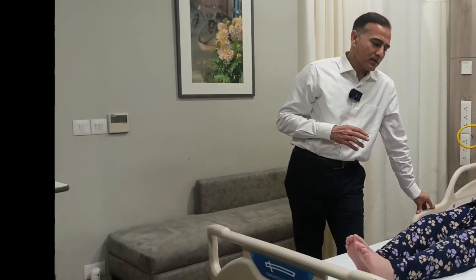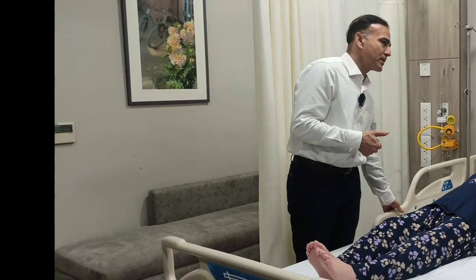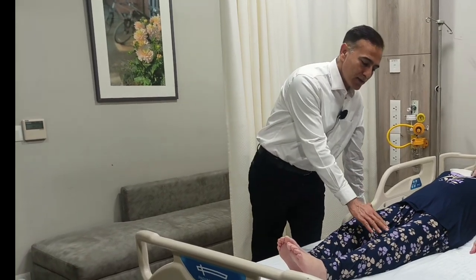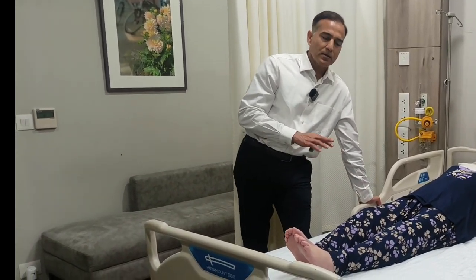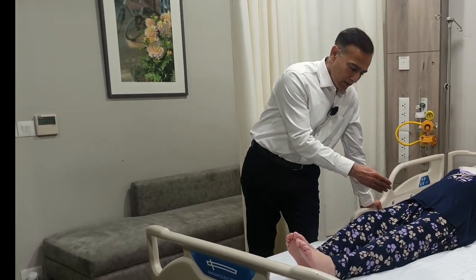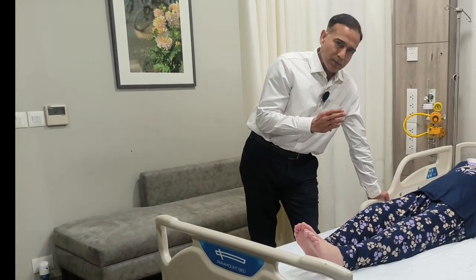She is 48 years old and she is from Uzbekistan — Tashkent. She had knee replacement on both sides in a different hospital about 8 years back. She was doing fine, but after a few years she started having pain, this leg got deformed again, and now she is limping.